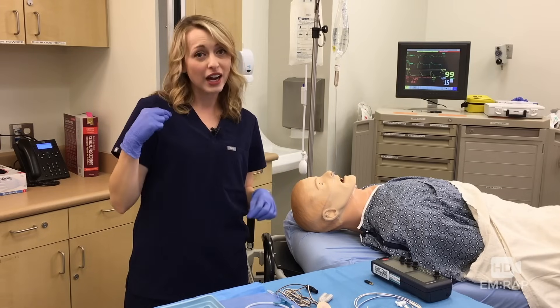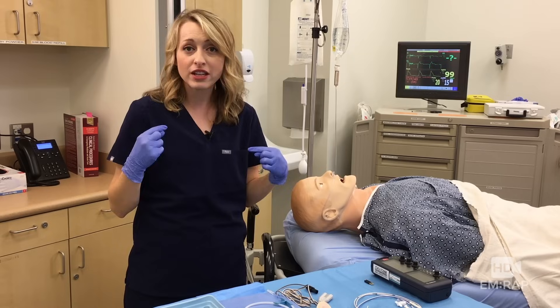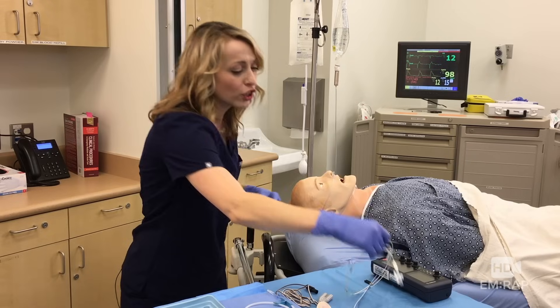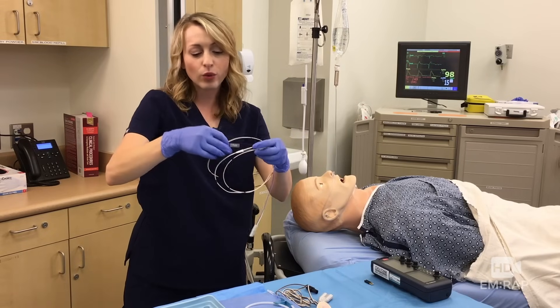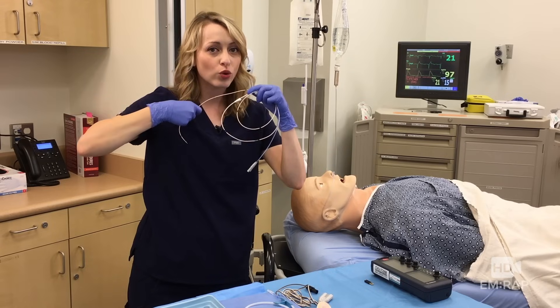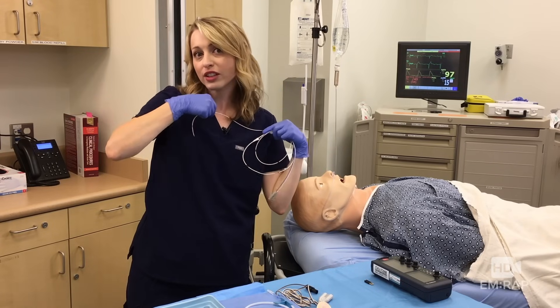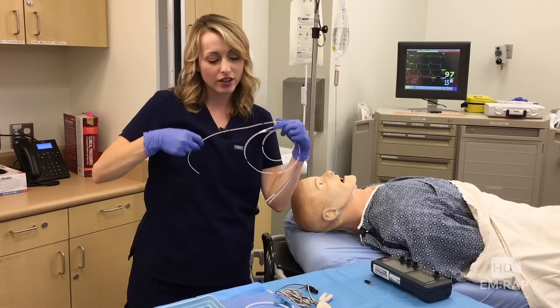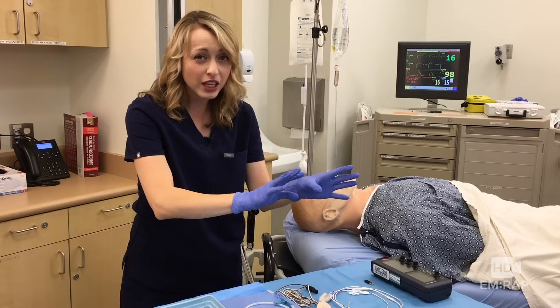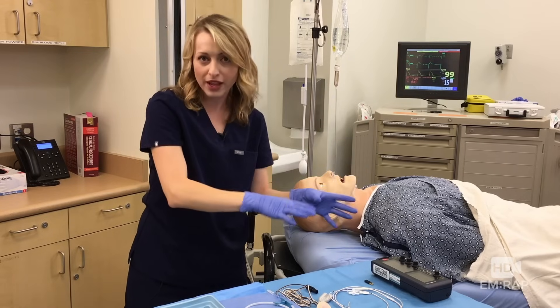We want to use either the right IJ or the left subclavian as the preferred sites because they're the closest to get to the heart. That curvature of the wire — we're going to use that to our advantage. If you go through the right IJ, it's going to curve towards the heart, and if you're coming across the left subclavian, again, it's curving towards the heart. If you can, use the right IJ instead of the left subclavian so we can save that for the permanent pacemaker.